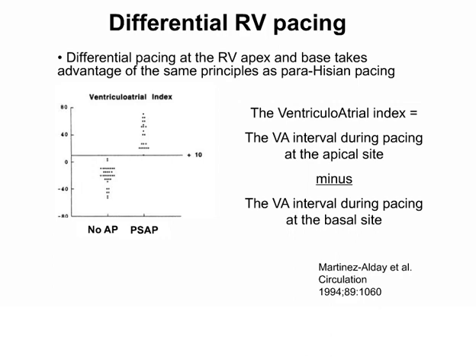The opposite is true when you pace through the AV node, because the apex is closer to the His-Purkinje system, the part of it that you can get into. So if you're pacing the apex, you're going to have a shorter time through the AV node than if you're pacing the base. They behave in opposite directions. You can use numbers like this, but if you just remember that concept, which one's going to be longer, that's really the best way to remember it and not try to remember formulas or anything else.